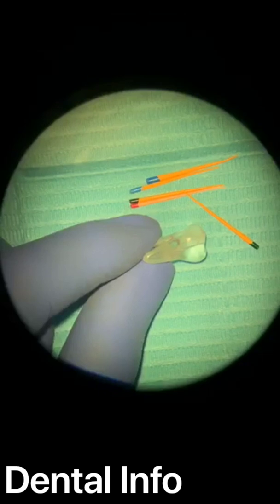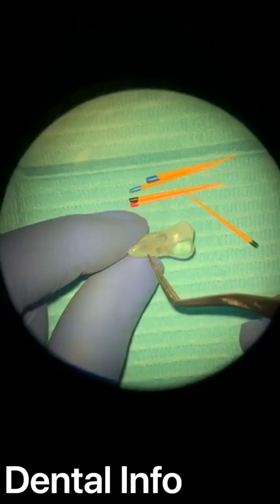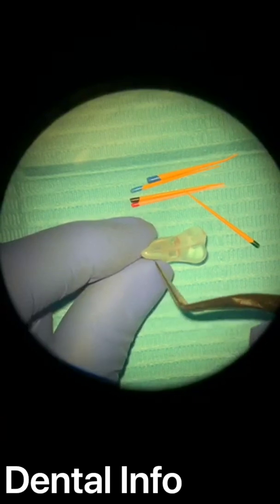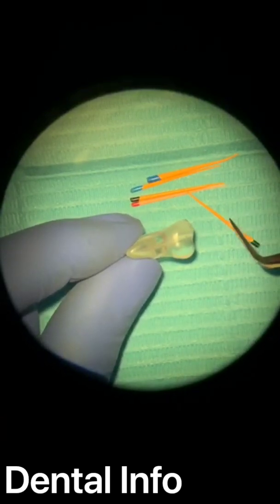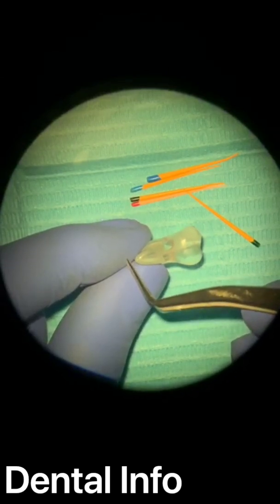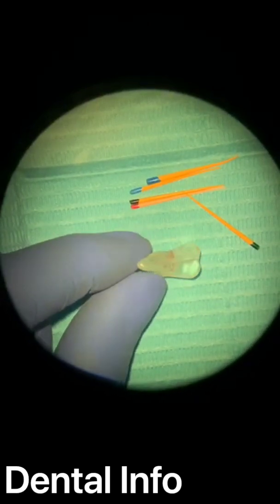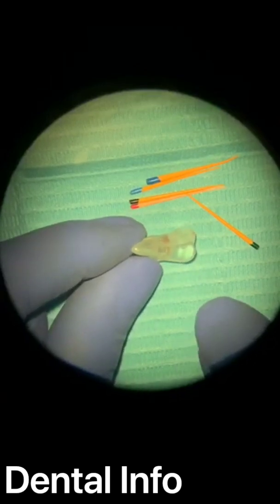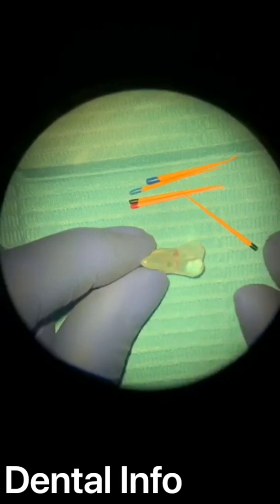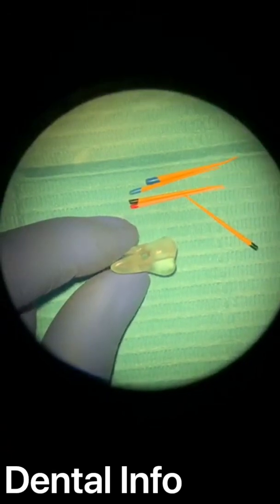That's the first thing. The second thing, to avoid canal contamination, because if you put the cone here and the cone will be extended over the canal and you take X-ray and pull it out again, you will contaminate the canal from the periapical tissues area, right? So keeping the canal wet will reduce this problem. So we never dry the canal before we gain our tugback and the cone fit in our canal. So let's start with the tugback issues.